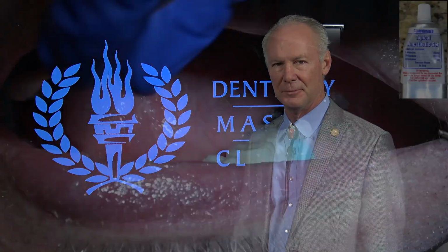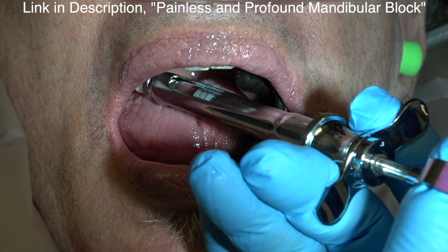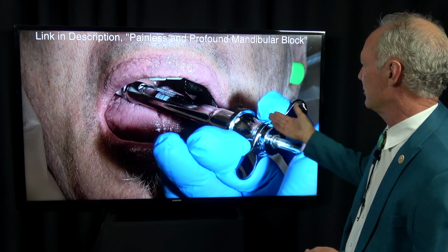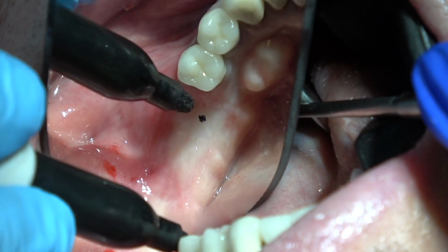Okay, so we're first going to place topical anesthesia, the patient's sedated. Watch this video on how to give painless and profound mandibular anesthesia, and watch the other video on how to give painless and profound maxillary local anesthesia. That's very important. Now, I'd start, and I'm placing a dot.